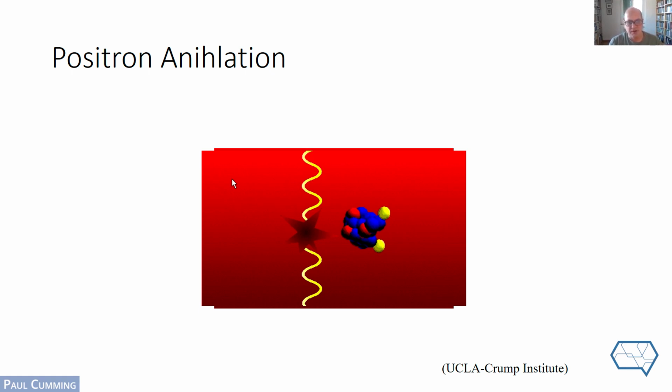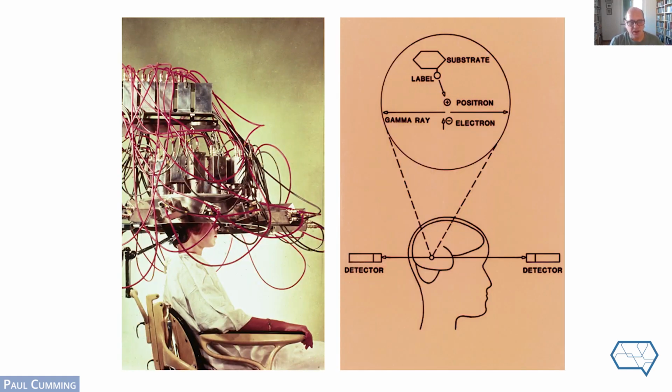Now that energy is very strictly defined by the famous equation E equals mc squared. And as it turns out, the energy of those two particles, those two photons leaving the site of annihilation, is equal to the rest mass energy of the electron-positron pair, 511 kiloelectron volts. Next slide. Now that is a high energy gamma ray, and that will pass through a centimeter of lead, and it'll certainly pass through your head.